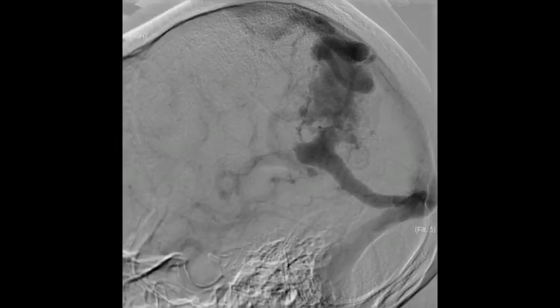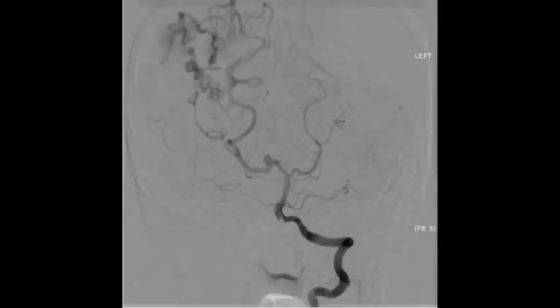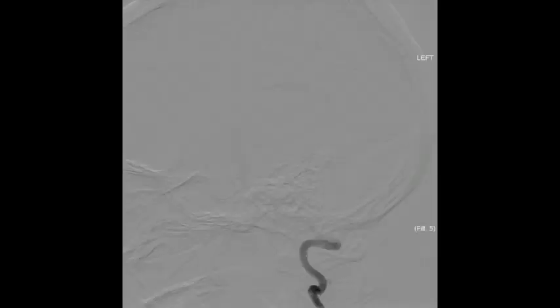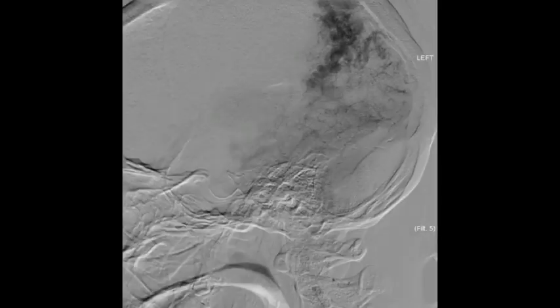As with any AVM, one must carefully inspect for feeding artery aneurysms. In this case, there was a clear P2 aneurysm measuring 5 mm seen on the coronal cuts. This AVM can be characterized as a lateral parietal occipital AVM.